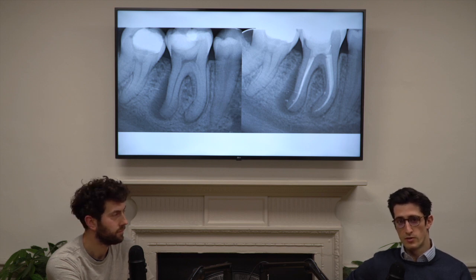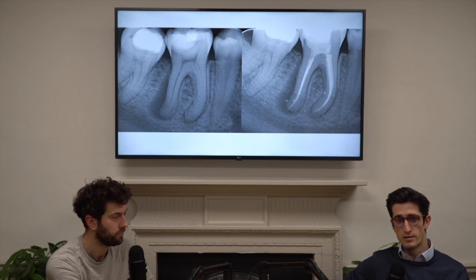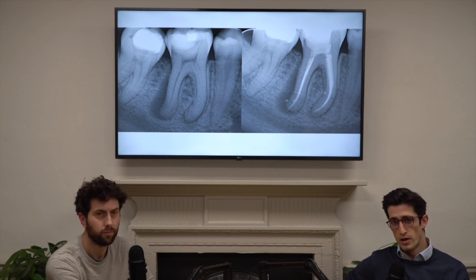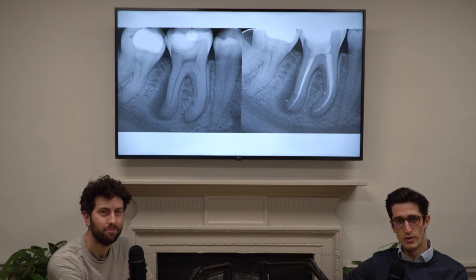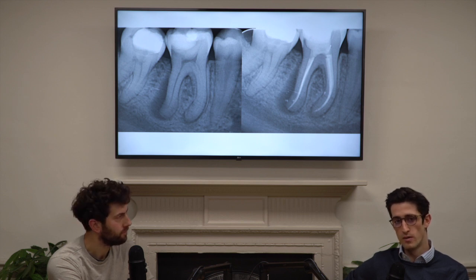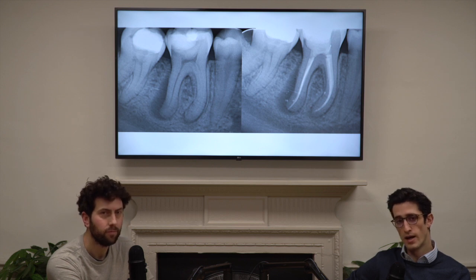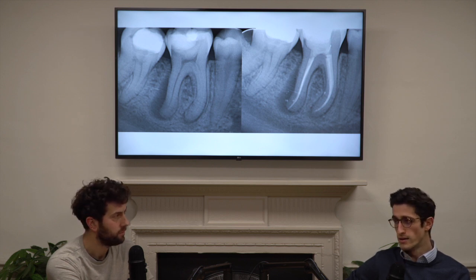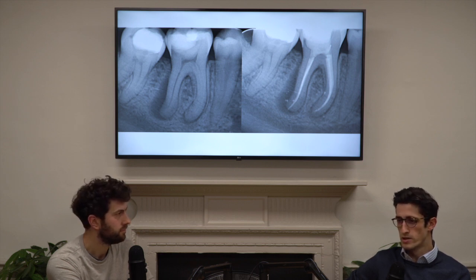So I think this was a tooth that was presented to me with a chronic apical periodontitis diagnosis. That periapical radiolucency of the distal root. Luckily, in this case, the canals are visible on the radiograph, so hopefully we can find them relatively easily. For once. Nice pulp chamber, so we remove the restoration, and in treatment terms, I normally scout with the size 10 file. Sure. Yeah. I take a size 10 file, a C-pilot. That's what I normally prefer to use, and find where the canals are and how far that file will advance unimpeded. At that point, I create what you described really well, which is just orifice enlargement.